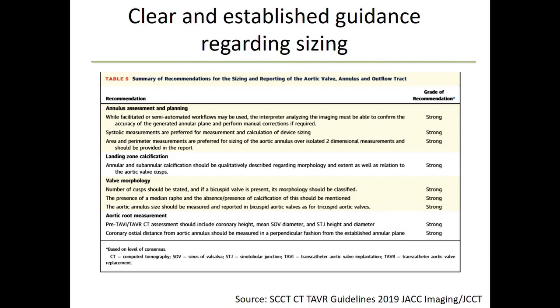We advocate for whole heart cardiac cycle imaging, sizing in systole, understanding the impact of diastole, using area for the balloon expandable device and perimeter for self-expanding devices, because perimeter will generally drive you to a larger device selection. We know the annulus is non-circular, and the perimeter of a non-circular structure is always larger than the perimeter of a circular structure of the same area. So that is why we use area for balloon expandable, not because it's better, but because it's a more conservative measure, and it allows you to put on the brakes and tell Dr.